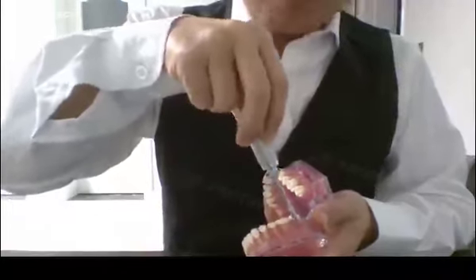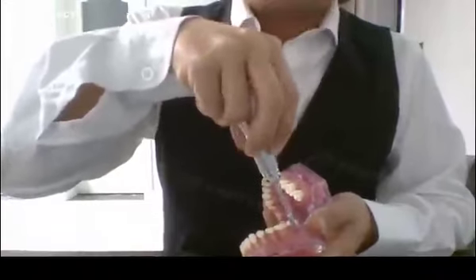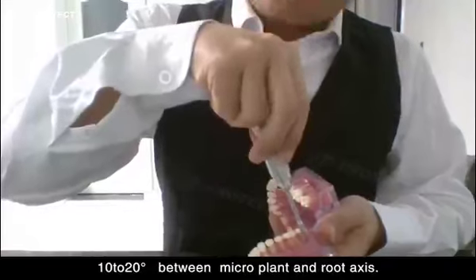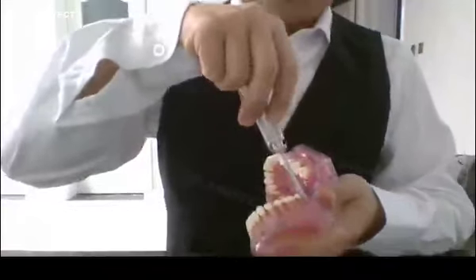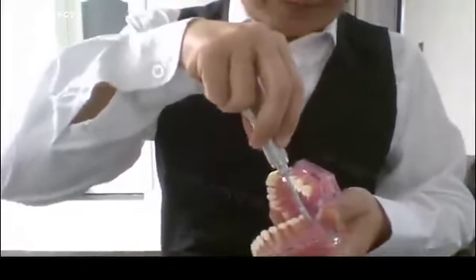Insert the micro-implant on the insert site with an angle of 10 to 20 degrees between the micro-implant and the root axis. Please do not change the angle when inserting.